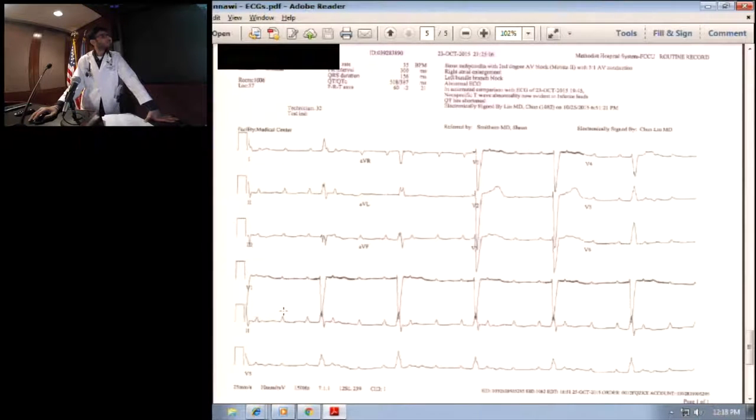When I was reflecting about this EKG, remember, paroxysmal AV block has basically two mechanisms. The simple way is to say you mess with the right bundle and you cause a block. Okay, that would be it. But why is your actual heart rate fast? It's on the faster side, around 100.